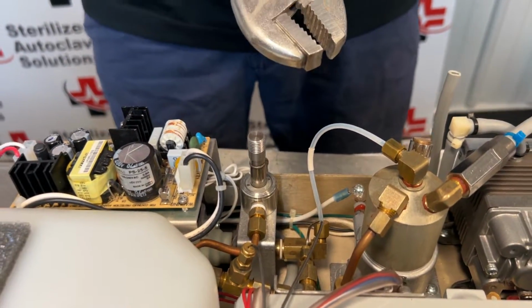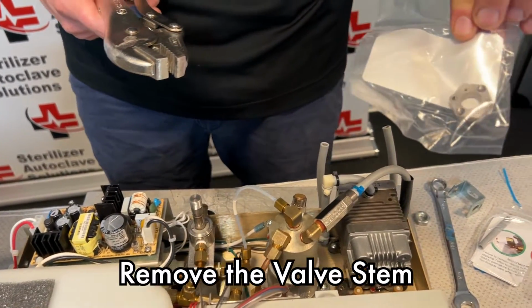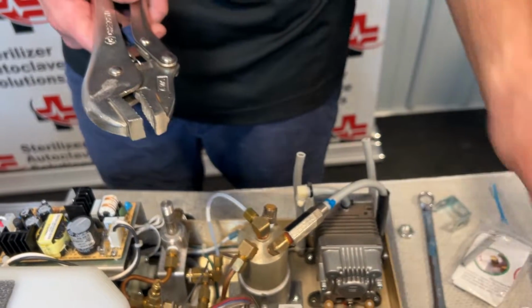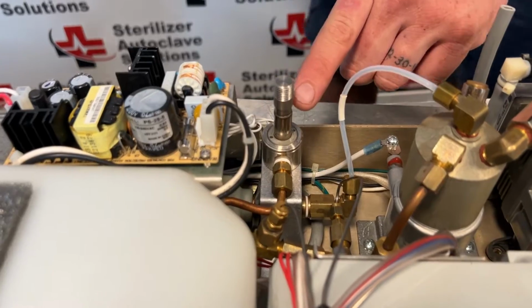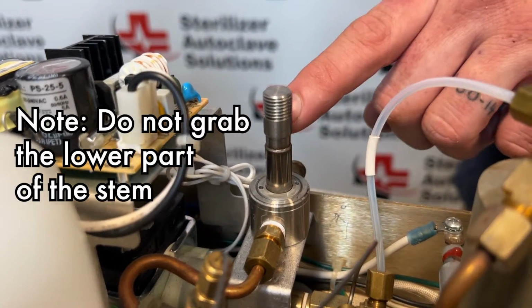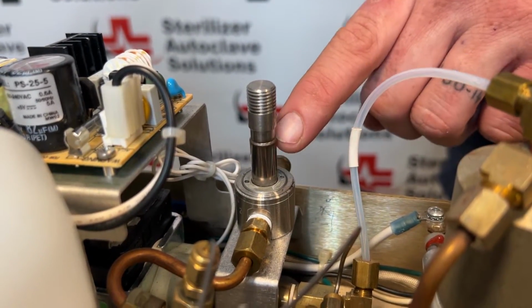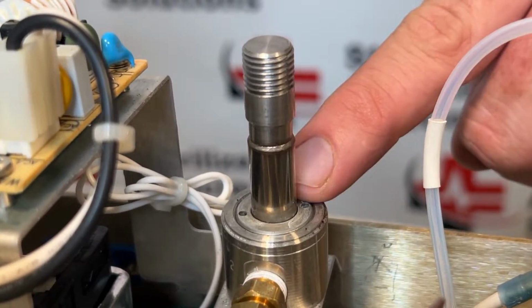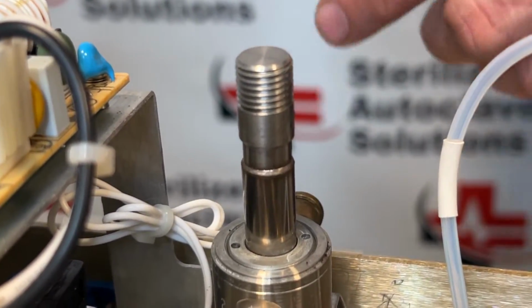Using locking pliers, I'm going to remove the stem. There is a stem removal tool, but if you use pliers, the locking ones work best. Where we're going to grab is right below the threads. There is a narrower part and then it gets thick again. If you grab in the lower section of here, you can damage the stem. If you damage the stem, you have to replace the entire solenoid. So I'm going to be sure to grab from the thinner part up.